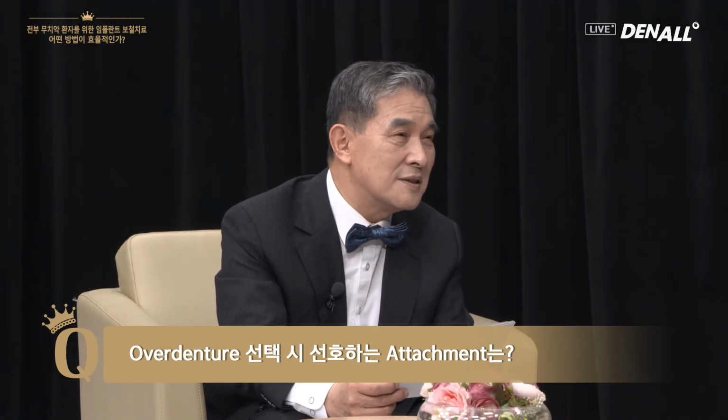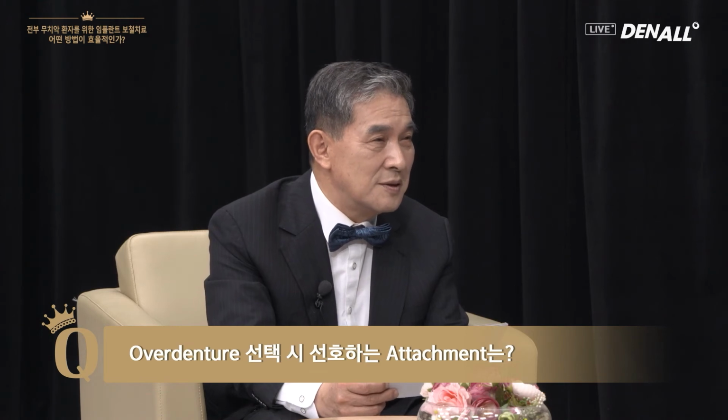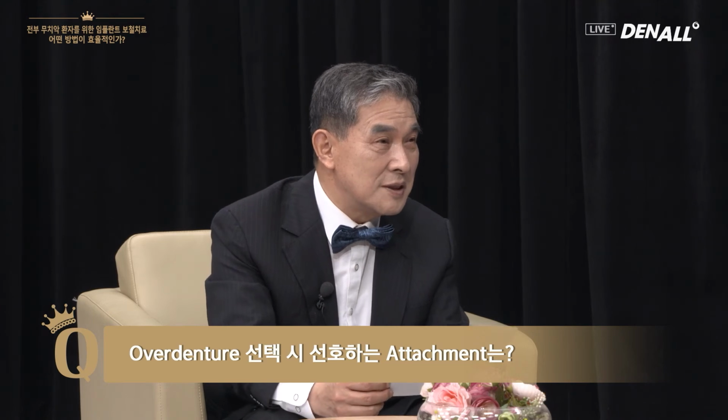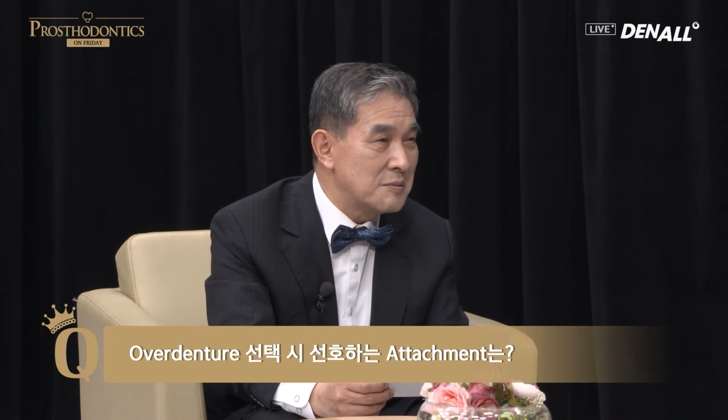Various attachments, I have used them as well. In the past, I used to use bar over denture, but these days, I use a stud attachment and locator the most. I think that is the safest way.